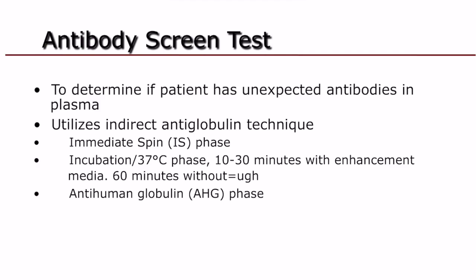Okay, let's talk about an antibody screening test right now and define what it is and what we use it for. An antibody screening test uses specific screening cells.